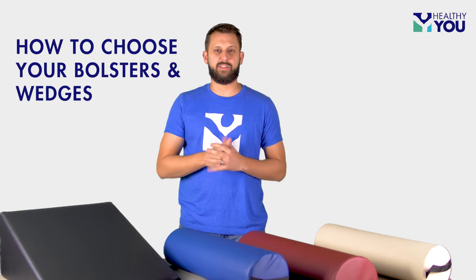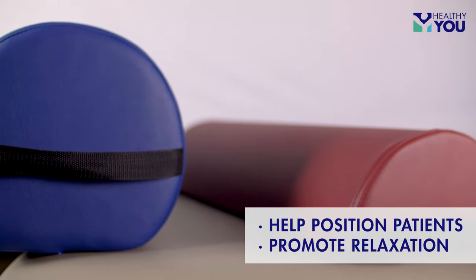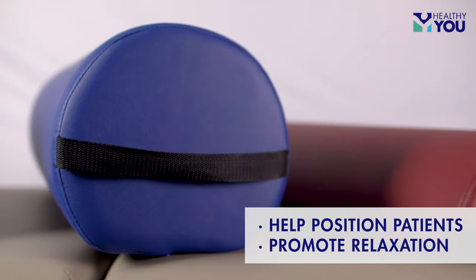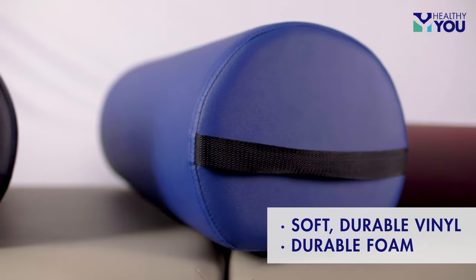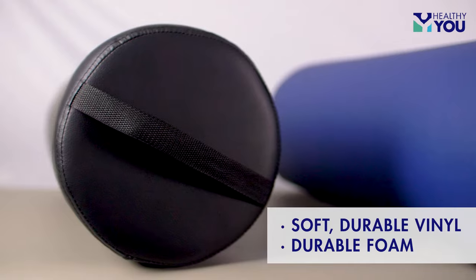Hello, I'm Tyler with Healthy U and I'm going to help you navigate through all the various size and shape options of our bolsters and wedges. They are designed to help position patients and promote relaxation. They are made with soft durable vinyl that is easy to maintain and durable foam that will hold up to heavy duty clinic use.